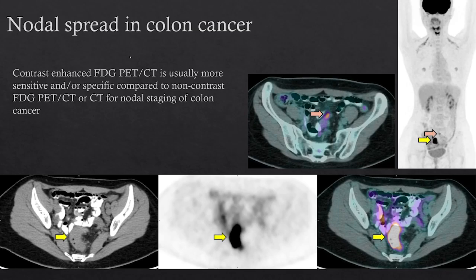Contrast-enhanced FDG PET-CT has been described as being more sensitive and/or more specific compared to non-contrast PET-CT or CT alone for nodal staging. In this patient, you can see an FDG-avid mass and focal uptake corresponding to a small node.